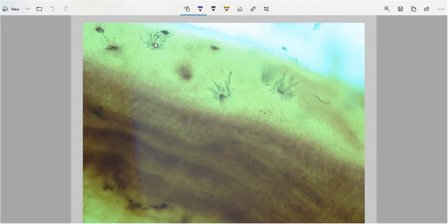These are similar to bone, in which we call these spaces osteocytic lacunae. And these are the processes that are radiating from the cementocyte lacunae, and these are known as the canaliculi.